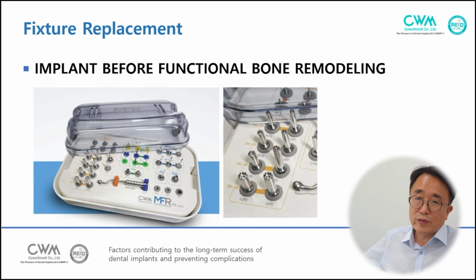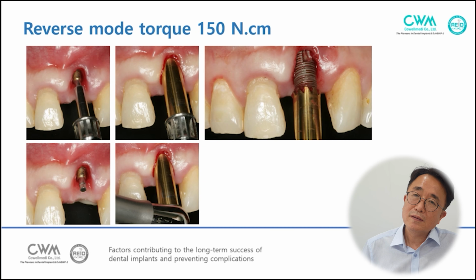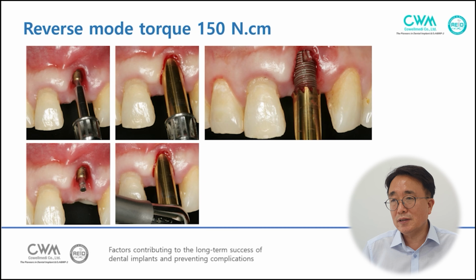At first, the connector screw is screwed into the implant, and then the second ratchet is connected, and then the counterclockwise turning is applied.